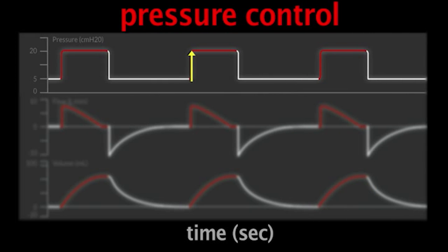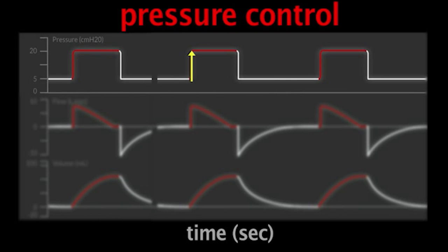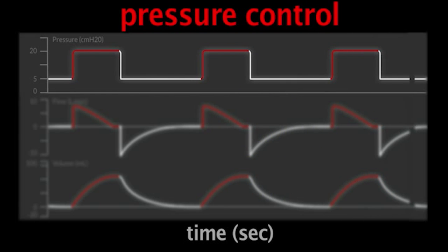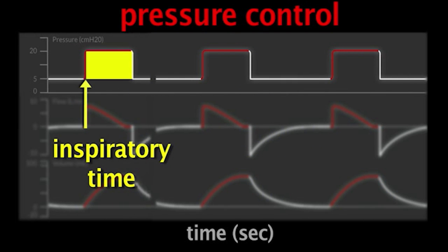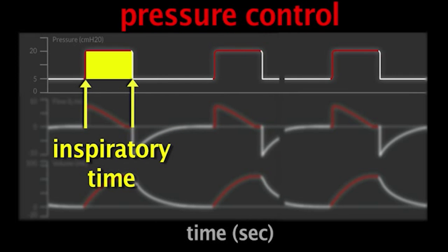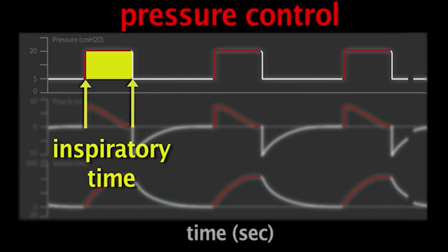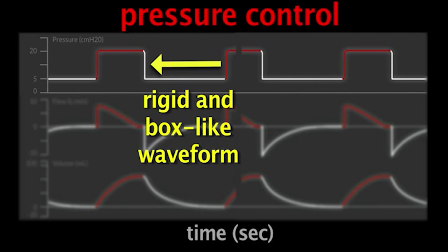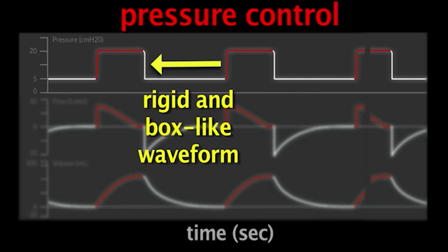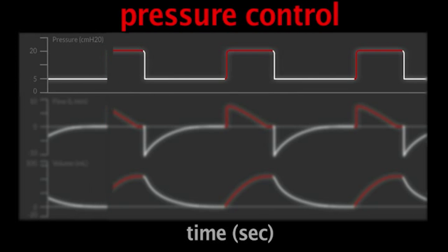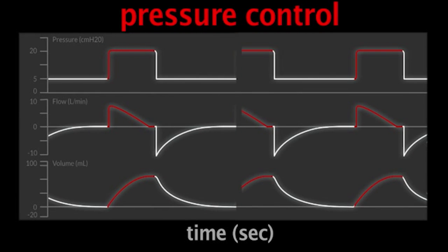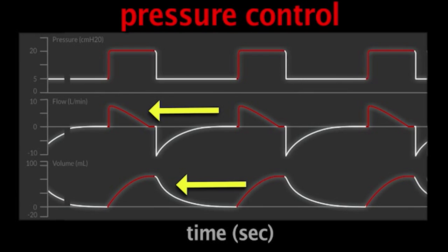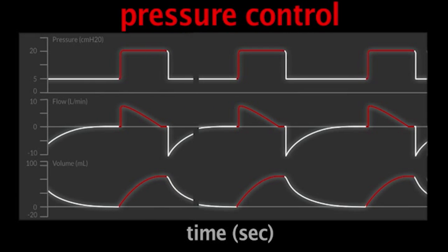When the ventilator cycles into inspiration — indicated by red here — we reach a peak inspiratory pressure of 20 centimeters of water. Furthermore, we can look at the time scale and calculate the inspiratory time set on the ventilator. You can see that the pressure waveform is very rigid and box-like. The variable being controlled — in this case pressure — will have this controlled feel. The other waveforms, flow and volume, will look slightly more organic because they depend on the patient's compliance and airway resistance; they are essentially uncontrolled variables.